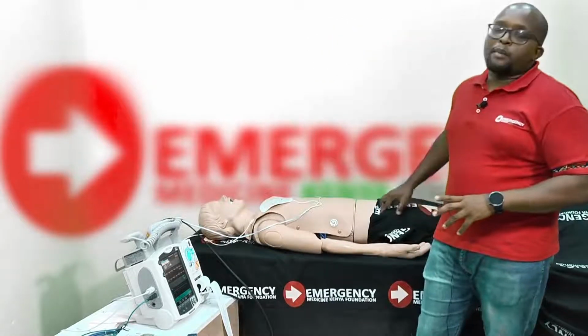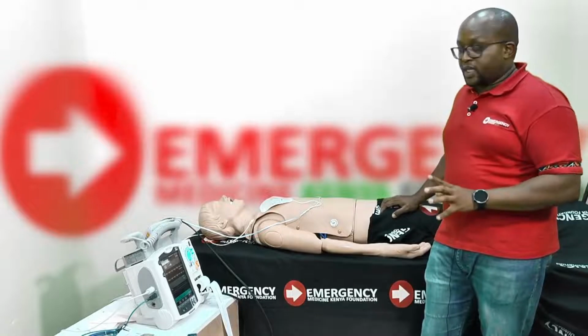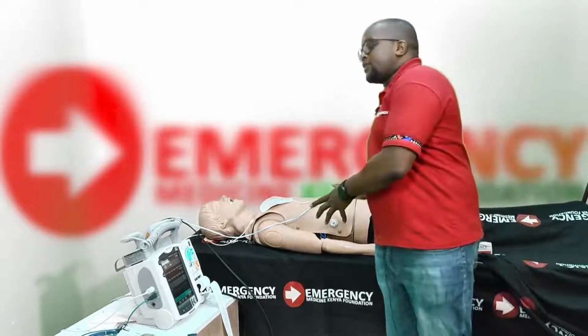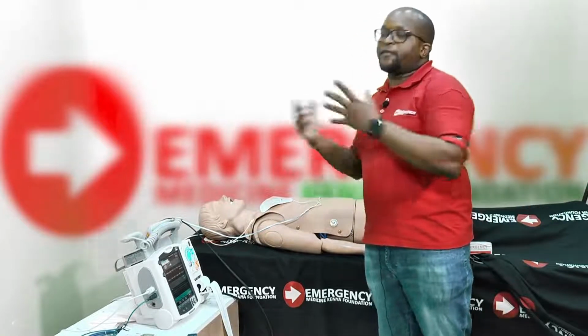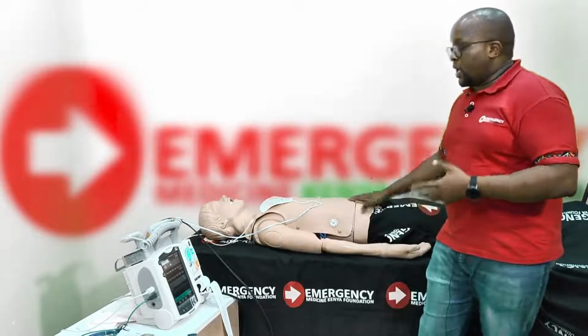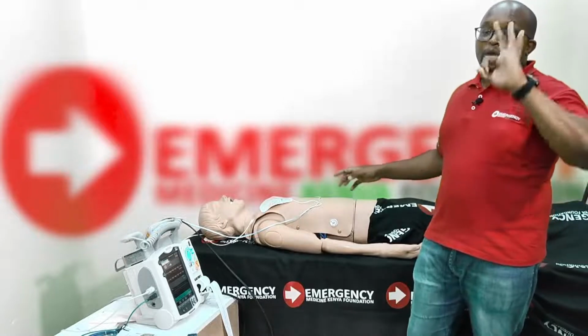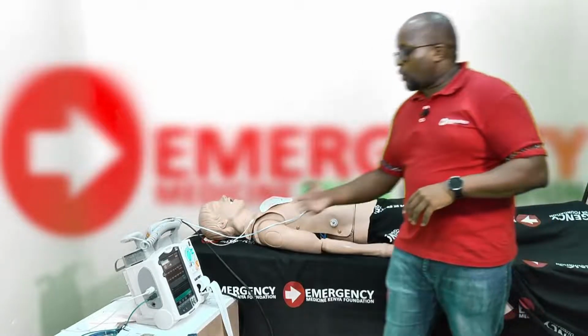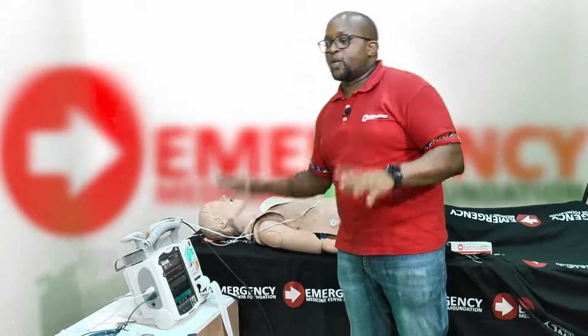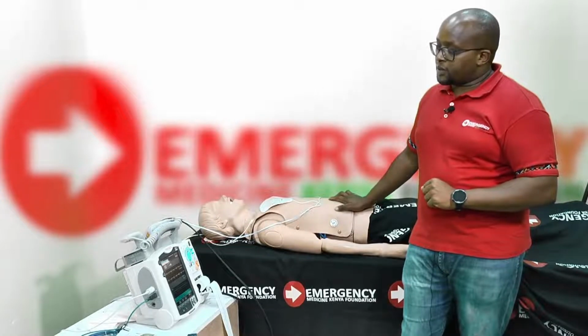Counter check that by feeling the patient's right femoral pulse for what we're calling mechanical capture, and then recheck your patient's vital signs to see if the features of shock have improved, blood pressure is better, and the patient feels a bit better and is perfusing well, which is what you're calling physiological capture. So 3 captures, and then go up by 10% on your pacer output as a safety margin, and have your patient transferred to the nearest cardiologist for them to take over.